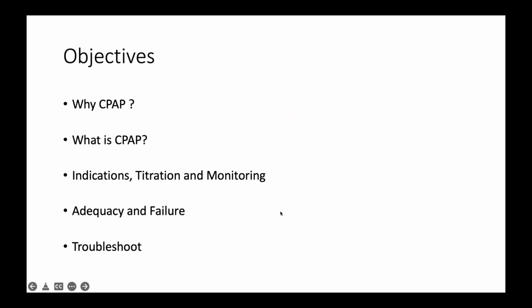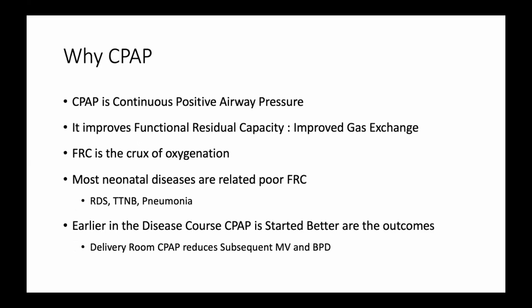I'm not going to be very high end, as Thiru said that we have to talk about pediatricians who would like to manage babies on CPAP and avoid a lot of ventilator jargon. But at the same time, some basic principles will help us manage babies in the SNCUs and level 2 centers and prevent up transfers. So what is CPAP?